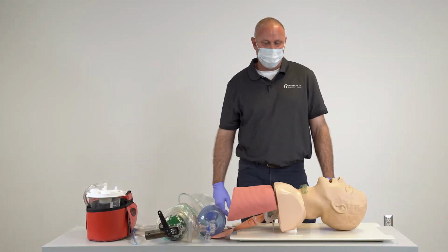This video will demonstrate the BVM ventilation of an apneic adult patient evaluation. Students will voice everything they are assessing, and their evaluator may clarify treatments during the assessment. You will be able to review your equipment before beginning the evaluation. Okay, I want to take appropriate PPE precautions.